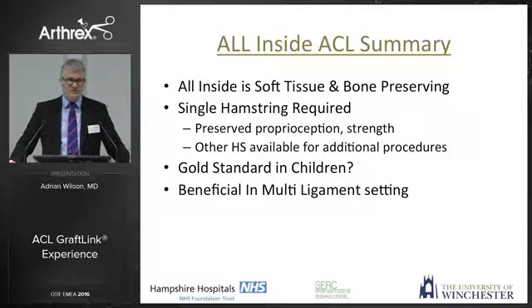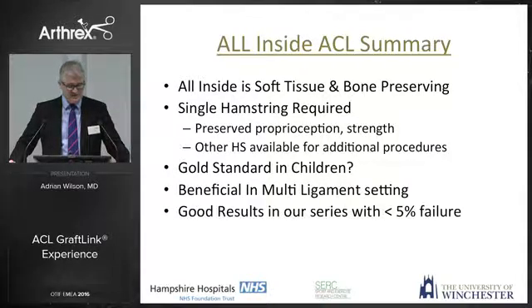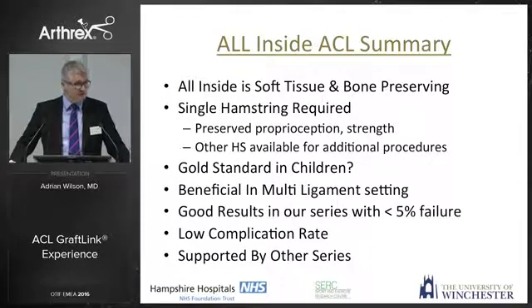It's very beneficial in these complex multi-ligament cases, and in our series we have very good results now out to 5 years with less than 5% failure and a low complication rate. And this is supported by other series which are now out there, and we hope very much.